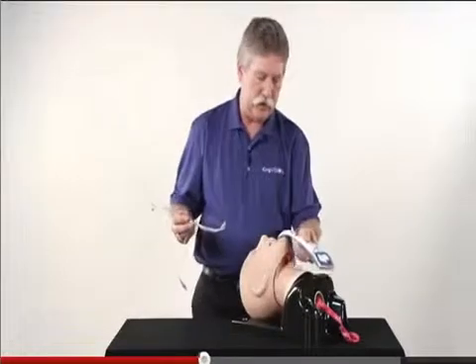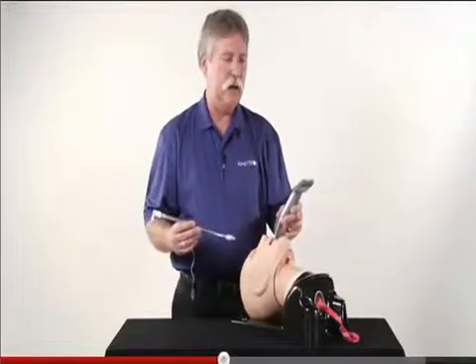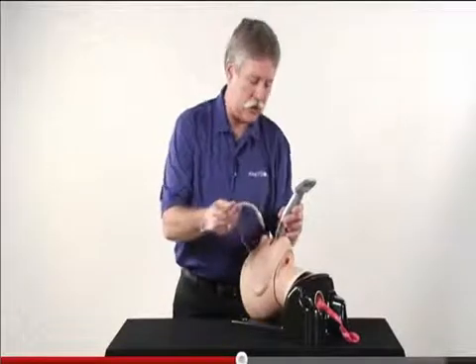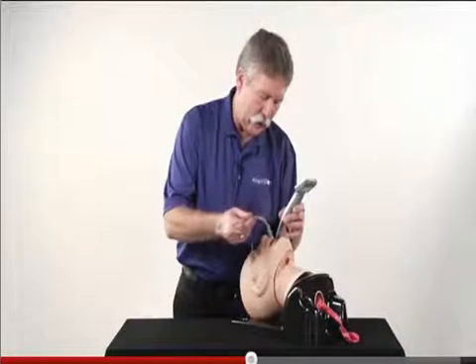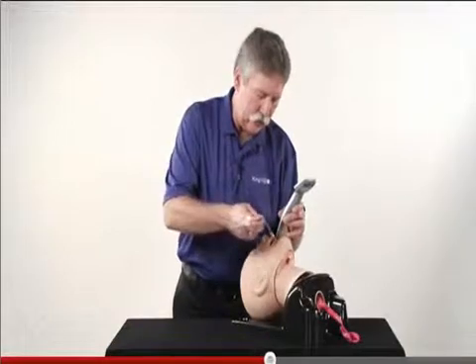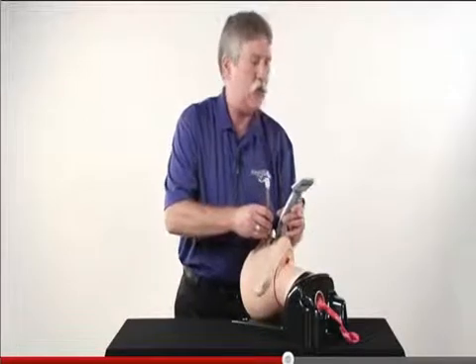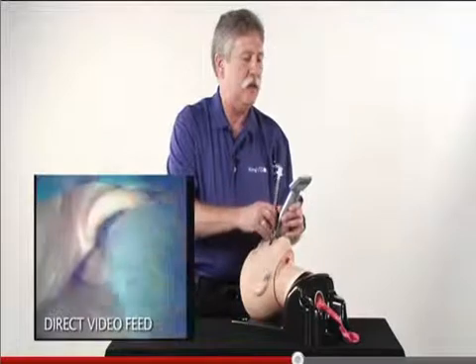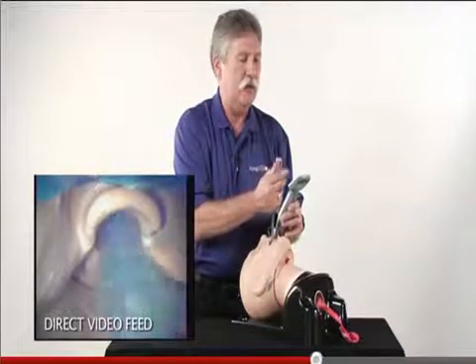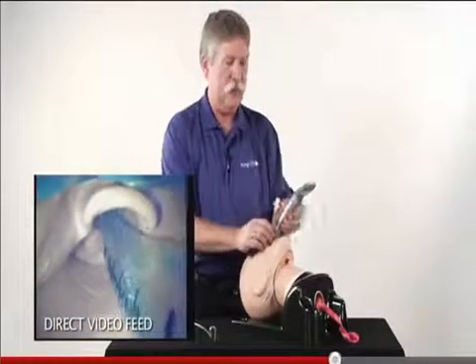So fundamentally, following the base of the tongue, as we've talked about before, putting the tip of the blade into the vallecula above the epiglottis, or underneath the epiglottis like a Miller style. Now you'll notice that I'm going to be actually looking in the mouth and following with the tip of the blade, or the tip of the tracheal tube, follow the curvature of the blade until I reach the posterior wall of the pharynx. Then I'm going to look up at the screen and watch as the tip approaches the vocal cords. Put it right at the entrance, then advance the tube off the stylet into the trachea, remove the stylet, and then remove the blade.